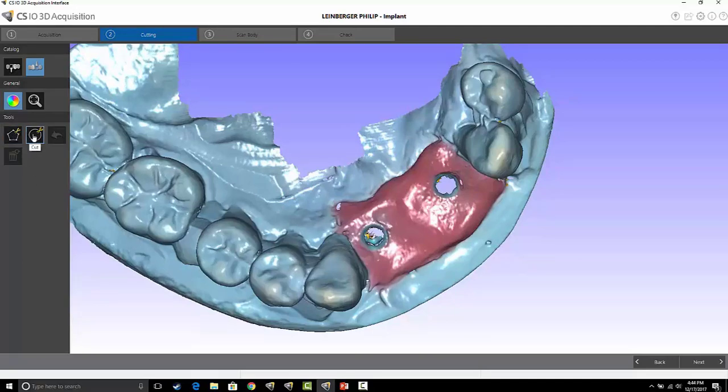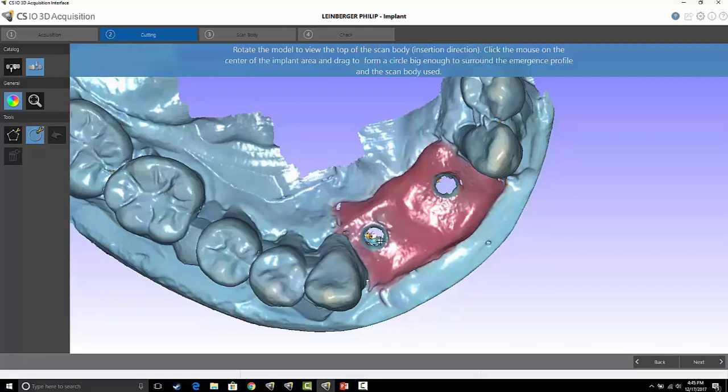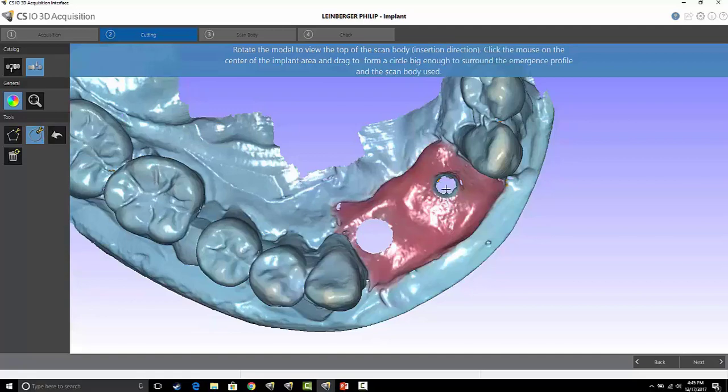I either have a free cut tool or I have a round cut tool where all I have to do is select the middle, left click and hold, and drag out the appropriate circle. I can do it again for my second implant.